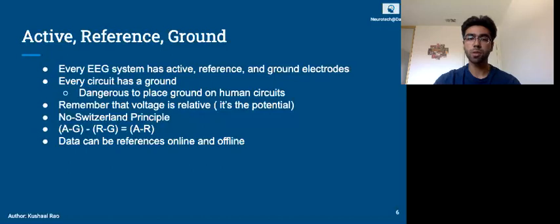When choosing a reference, you want to choose something that's convenient. You want to choose an area that's not biasing one part of the head from another. So if you're choosing to use one right mastoid, you should probably balance it out on the other ear as well. You don't want to put it where there are too many big muscles. So you don't want to put it near your neck or near your jaw, because those are huge muscles that cause a lot of distortion in the data. And you want to avoid placing a reference where the component is obviously going to be strongest. If there's a strong thing that you're looking for near the occipital lobe, you probably shouldn't place a reference in the back of your head, because the idea is to try to isolate the component, not make the reference as similar to the active electrode.